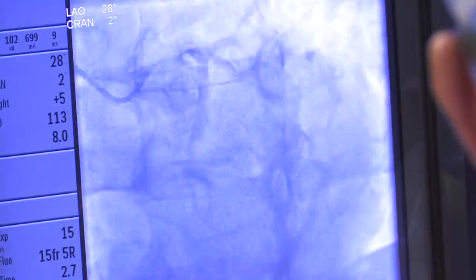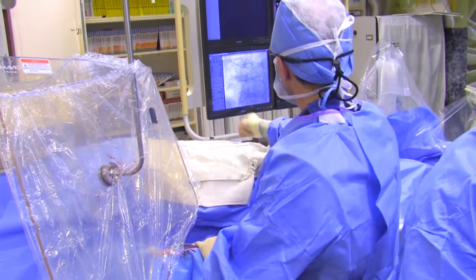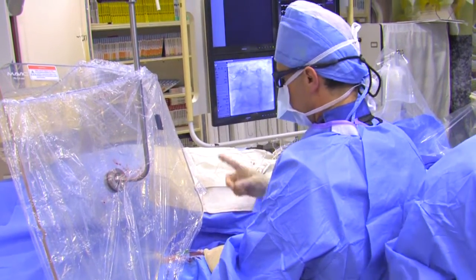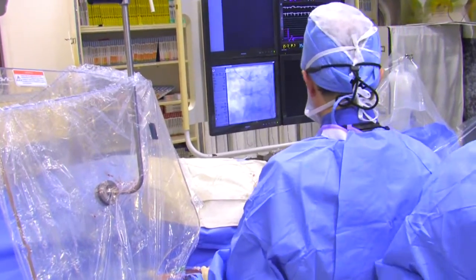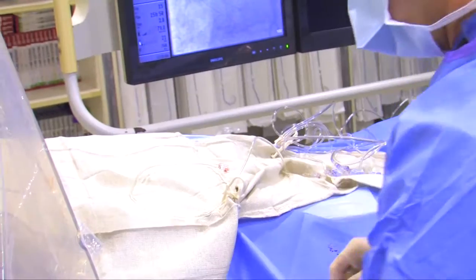Let's try one more time to go to the left coronary artery, but we may need a catheter with a different shape because this one doesn't quite fit him. It's just a little bit short. We'll need an exchange wire. So this catheter isn't fitting into the artery well enough for a nice picture, so we're going to exchange for a slightly larger catheter. In order not to lose our place, we're going to insert a long wire down there to hold our place, remove this catheter, and then put a new catheter over that wire.